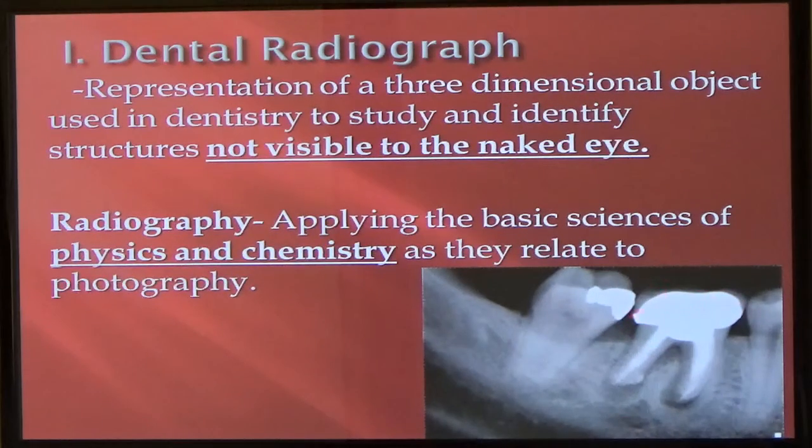Okay, what we look in there, we know he would have a metal filling, either gold or silver. We could see that he's got a crown. We probably wouldn't be able to tell that he has a root canal through the crown unless there's a hole through the crown. And we definitely wouldn't be able to see that he's got an abscess going, these shadows down here, he's got an infection, unless we took a radiograph.